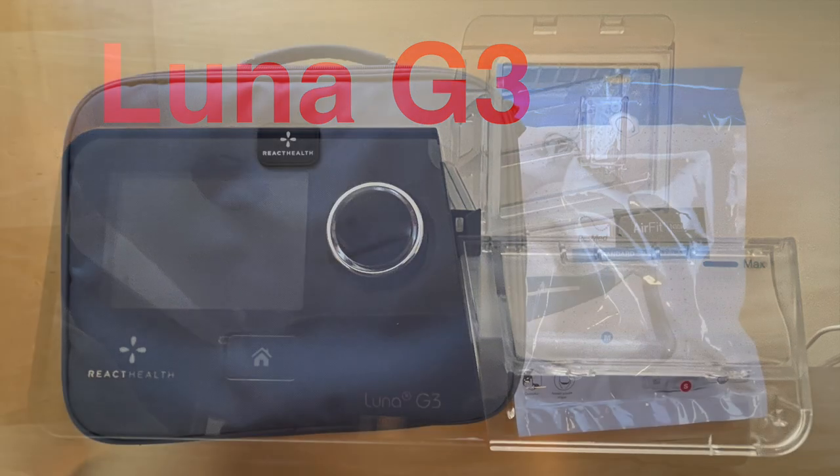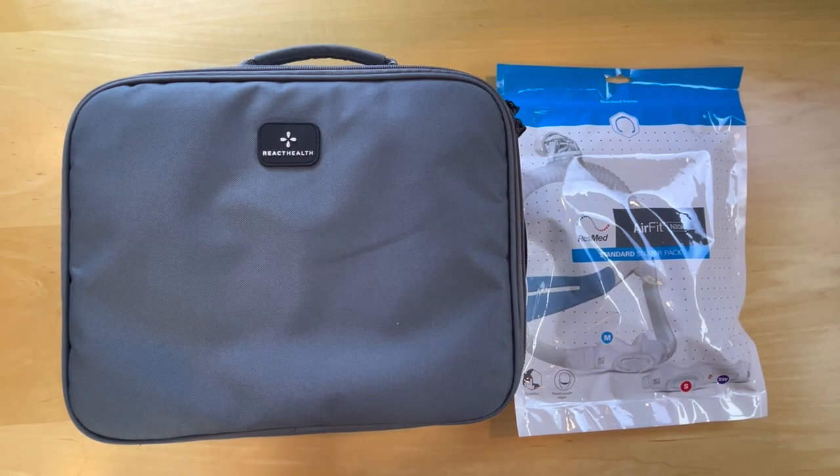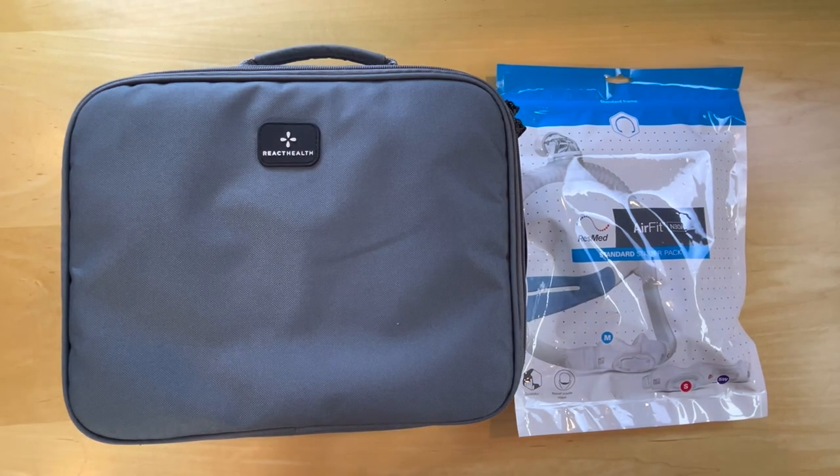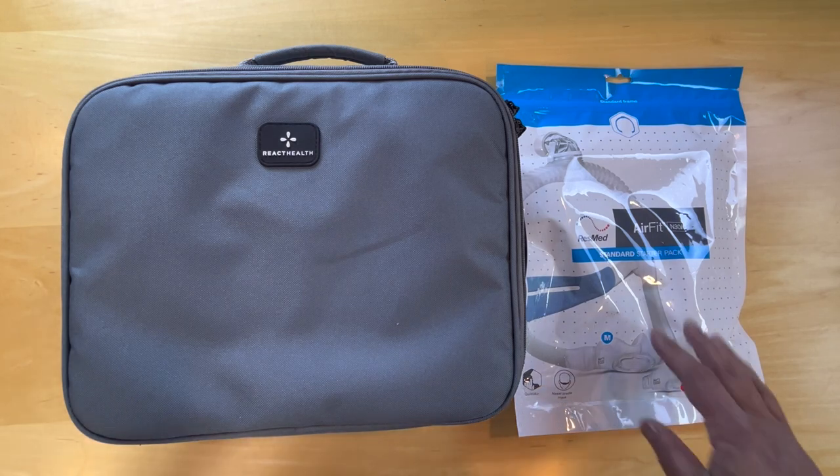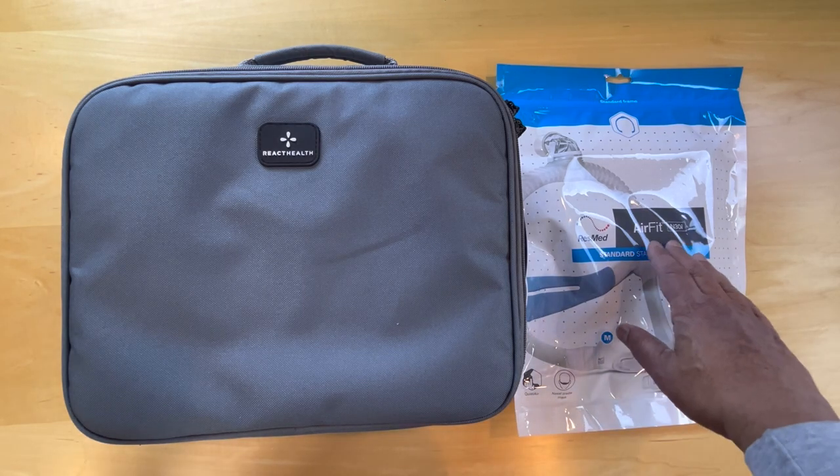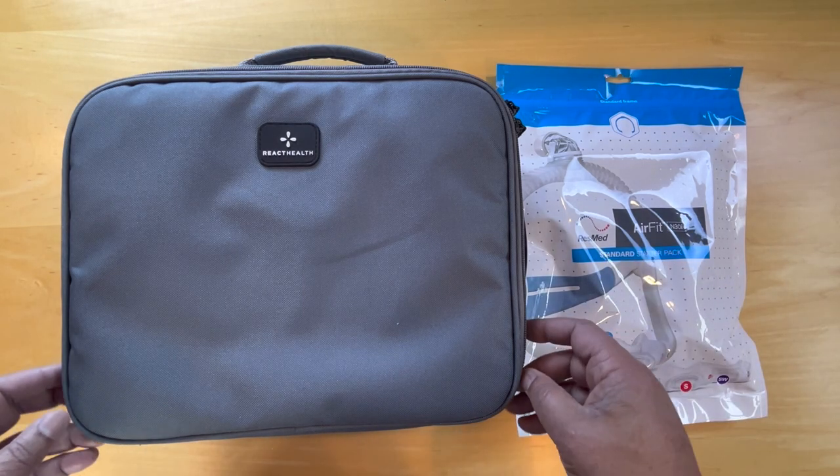Hello and welcome. Today we're unboxing a CPAP with an AirFit N30i hose connection.